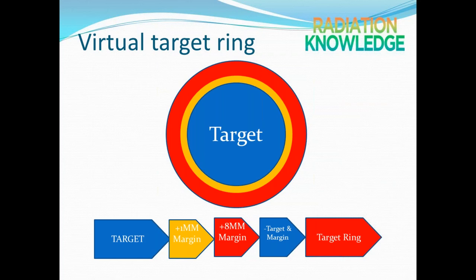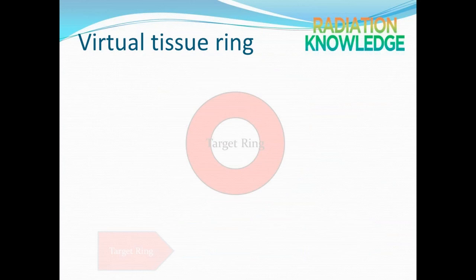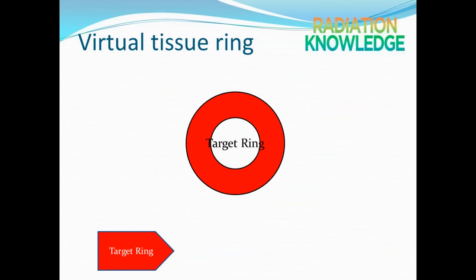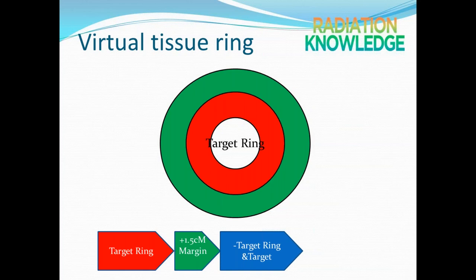Outside the target ring, we also create a virtual tissue ring with 1.5 cm margins, similar to the target rings. We subtract the target rings, targets, and margins to get the tissue ring — shown in green. Both the target rings and the tissue ring are used to control the dose fall-off, ensuring the target dose drops rapidly outside the target.